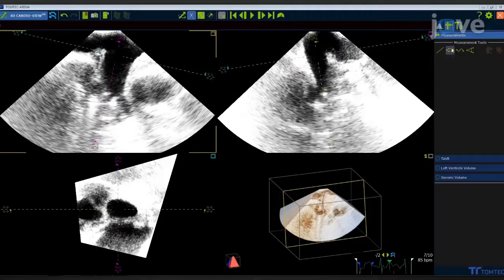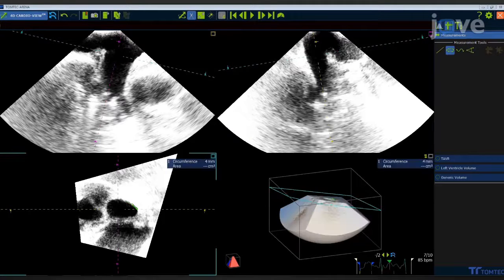Acknowledging the dimensions and anatomical variations of the pulmonary veins is important when planning pulmonary vein isolation, which contributes to improving the outcome of the intervention. 3D TEE is an alternative tool to visualize the pulmonary veins before pulmonary vein isolation because it can evaluate relevant diameters and areas of the pulmonary veins and their spatial relationship to surrounding structures.